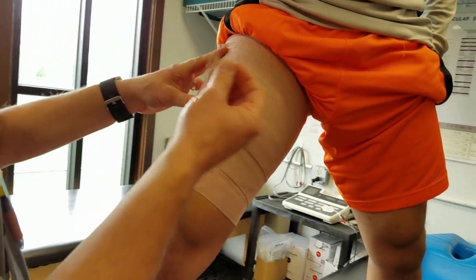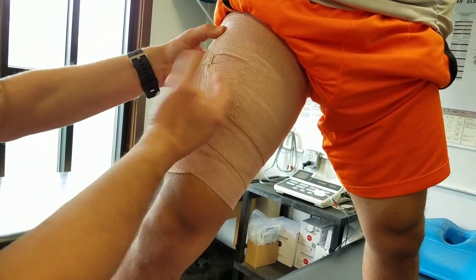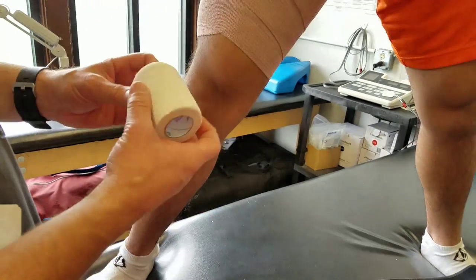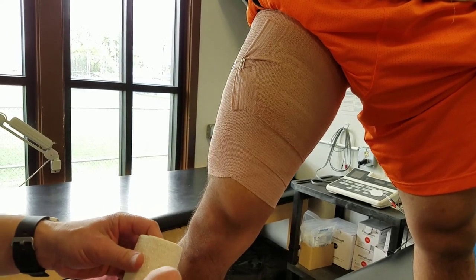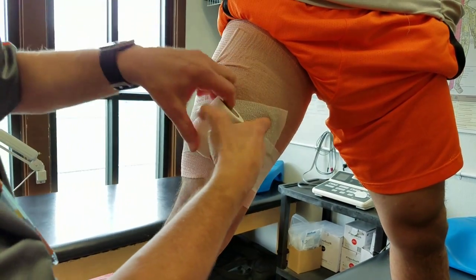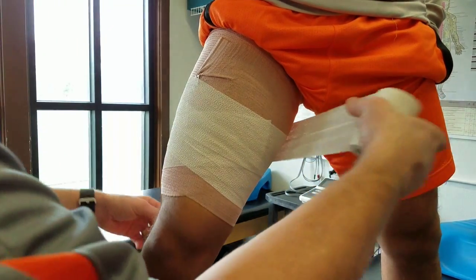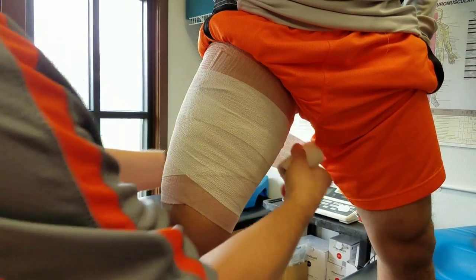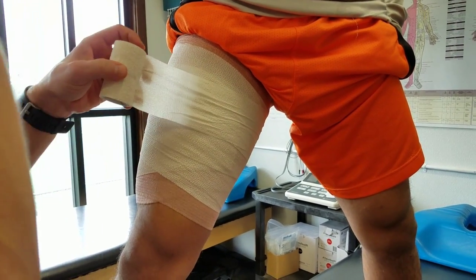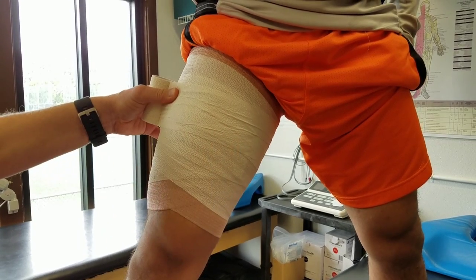I don't endorse using the clips for activity — I'm just using them right now to hold it in place to show you. To secure, just like with other ace wraps, I like to use the coflex and follow your pattern. You always have to be a little concerned that it's not on so tight that the athlete has a hard time moving. Sometimes it's a little trial and error — you may have to do it once or twice to get the right amount of compression and tension.